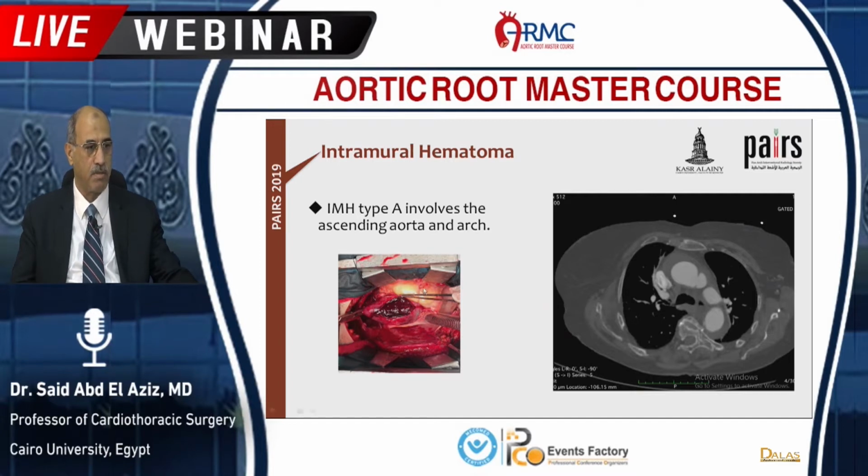Like here, this is a surgical case where we have the hematoma inside the adventitia, more than 5 millimeters around the ascending aorta and part of the arch and the descending, and this is the cause of the hematoma.